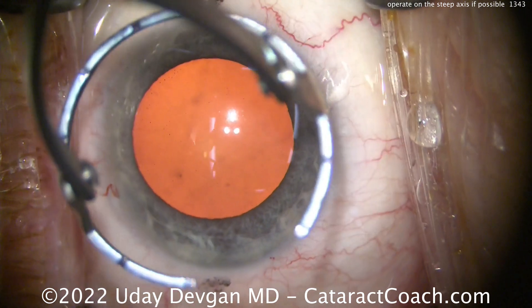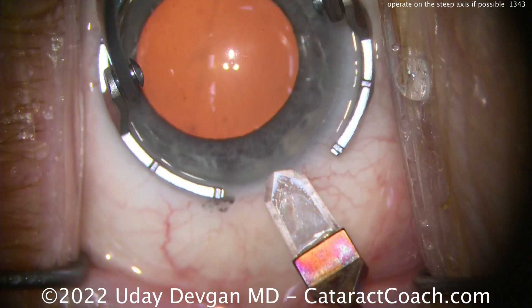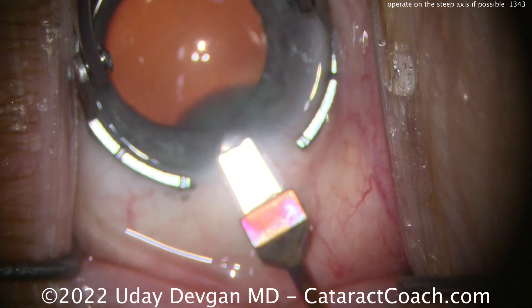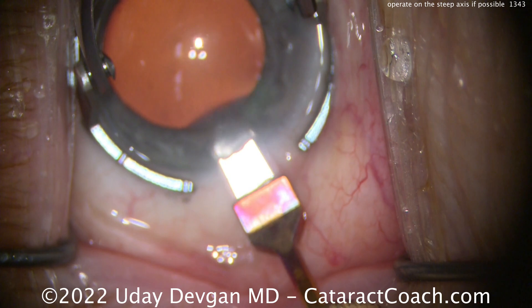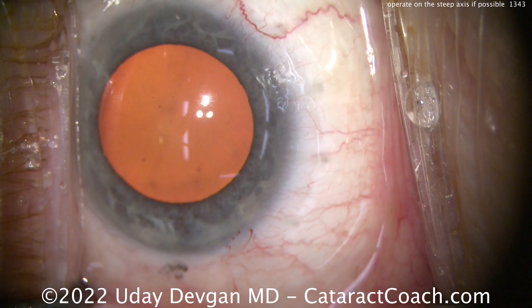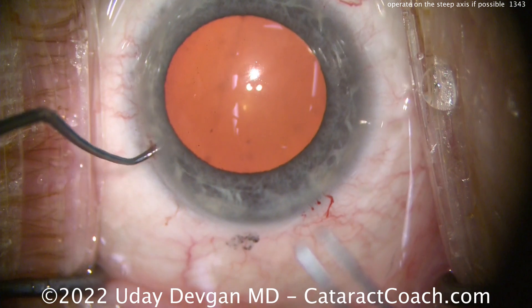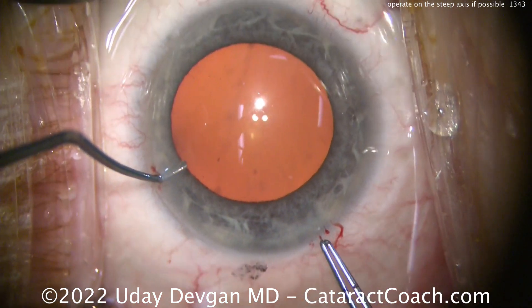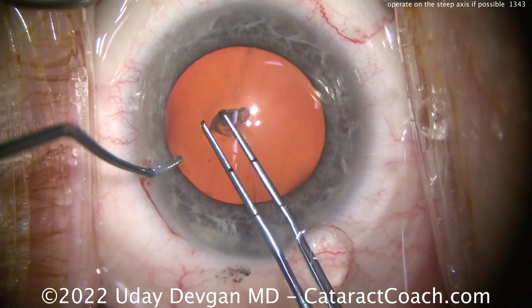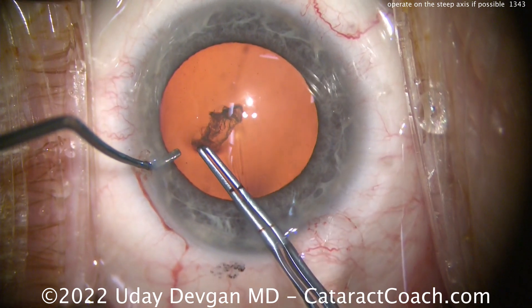In this case I'm going to shift my incision to about the 30 degree meridian. Look at my fixation ring — all those marks are about 30 degrees or one clock hour apart. Making the phaco incision there on the steep meridian of 30 degrees. The black marks are zero and 180 degrees, and that's going to help neutralize any pre-existing astigmatism. If you're just starting as a resident, I frequently hear residents say they like to make the incision for the comfort of their hand.